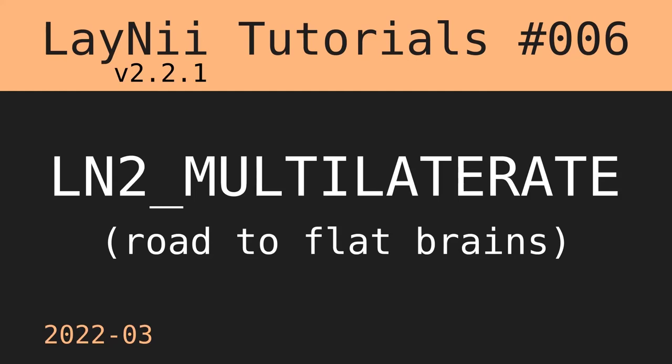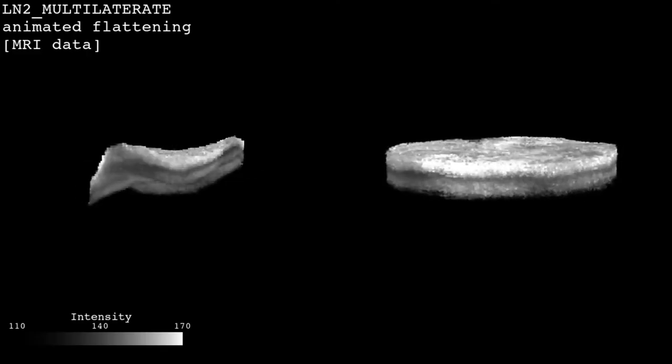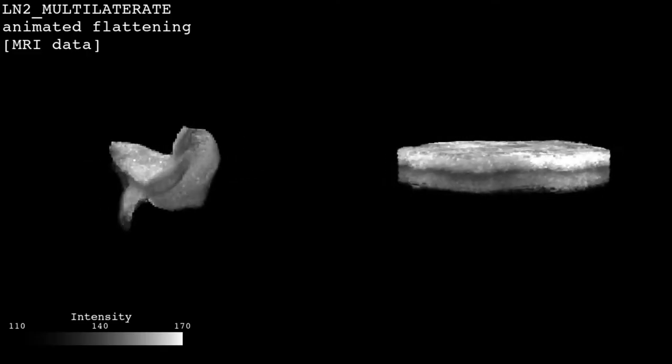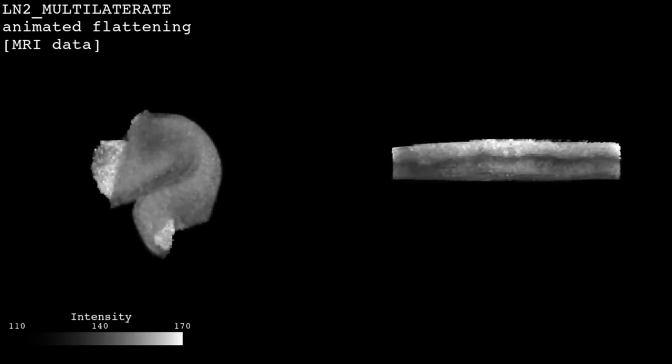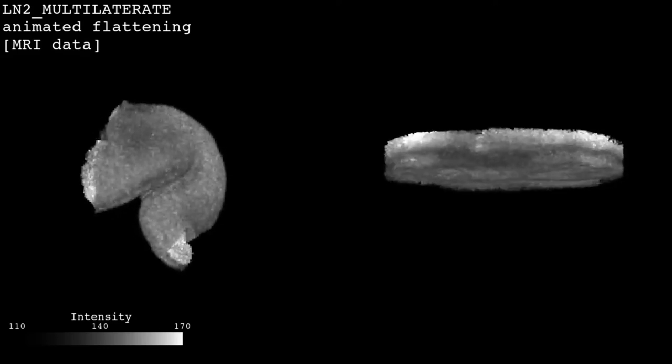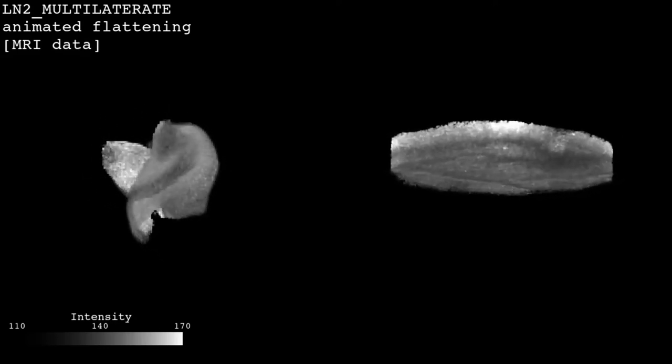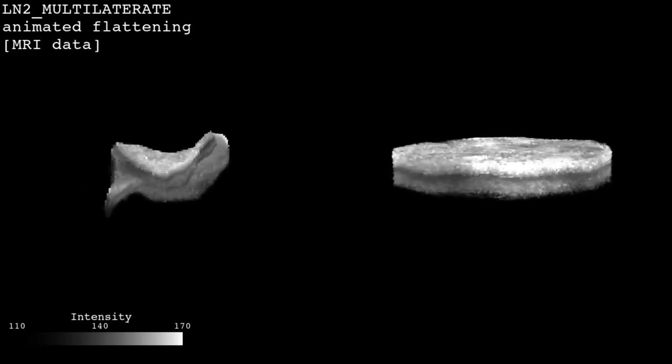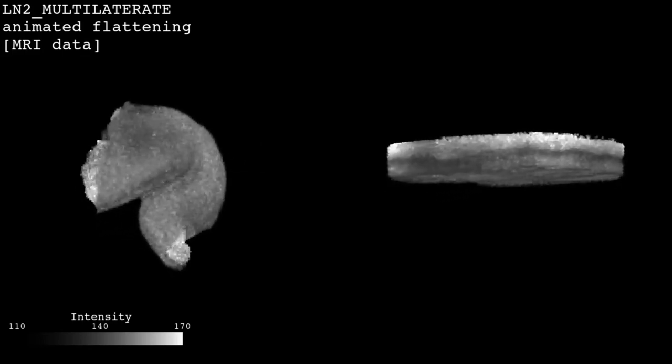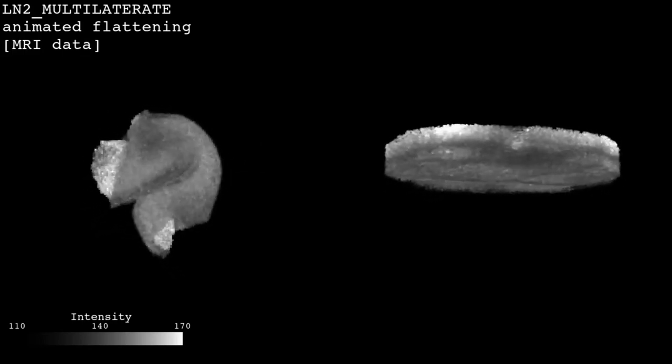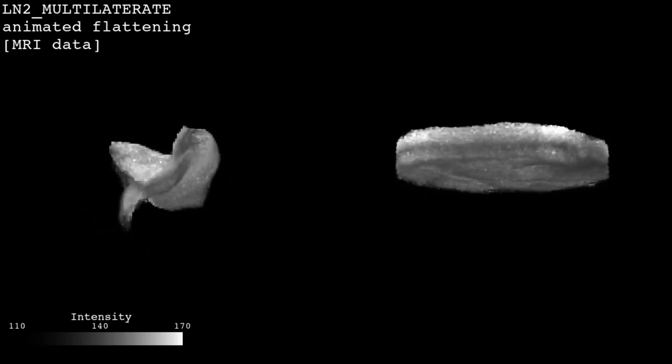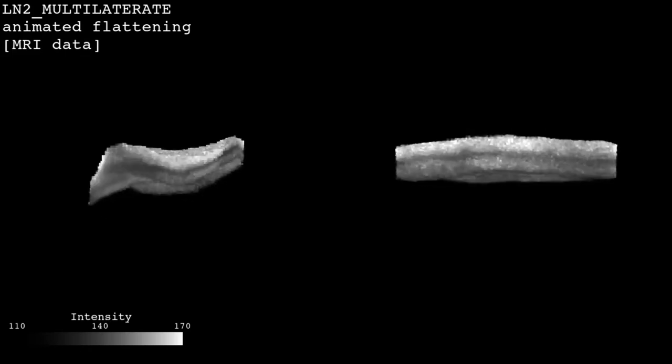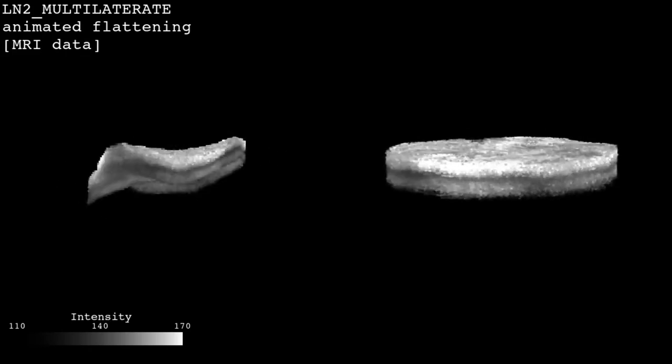Did you know that you can flatten brains in Laney? Today I am going to talk about how to flatten cortical chunks in Laney. Here in this animation on the left side you can see that from a folded cortical chunk of brain tissue we are transitioning into a flat pancake like format.